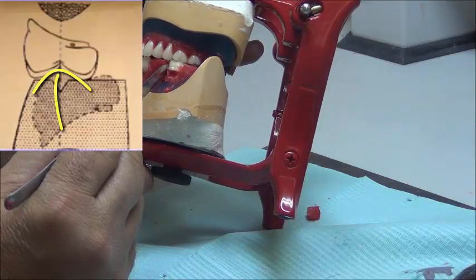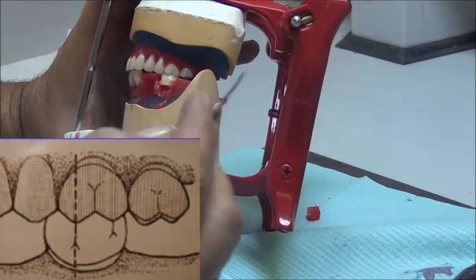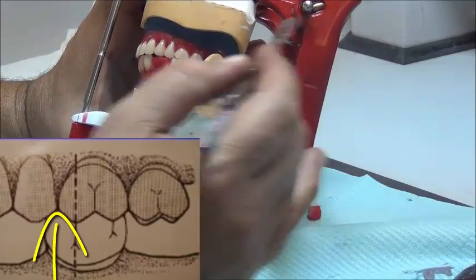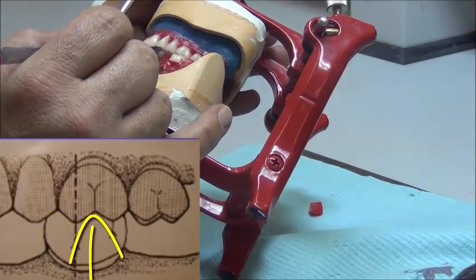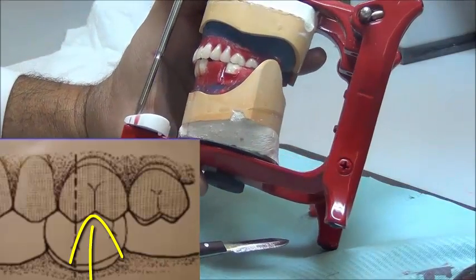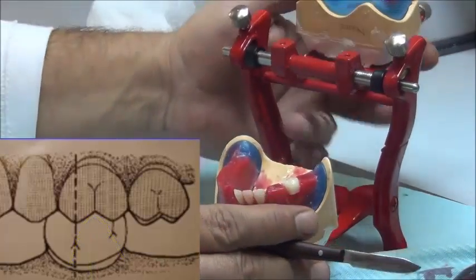So after we put it into place, and we put the cusps in location buccally, we make sure it's in location. The mesial cusp of the lower is in between tooth number 6 and tooth number 5. The distal cusp is a bit less than the distal cusp of the upper molar. So it's larger mesiodistally than the upper molar, so it extends for a longer period.